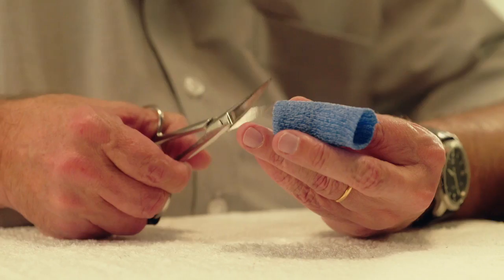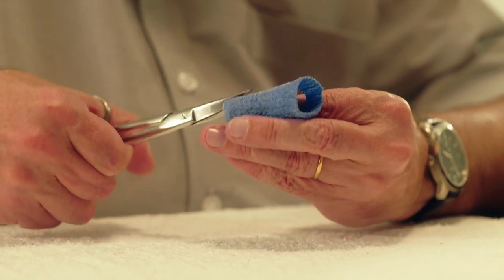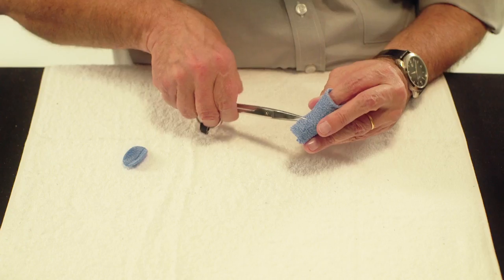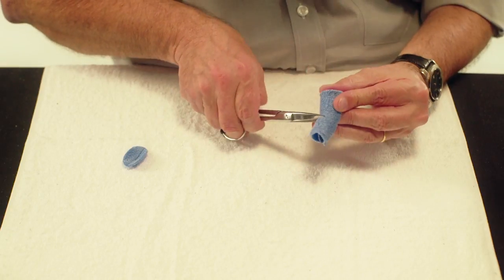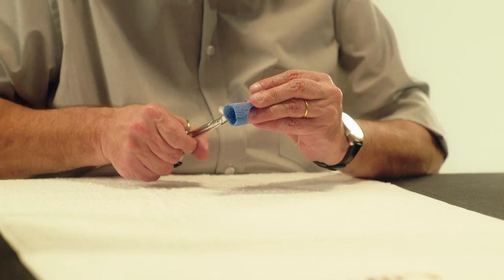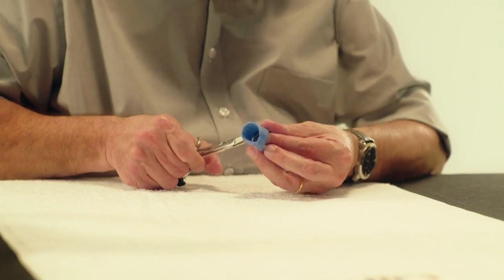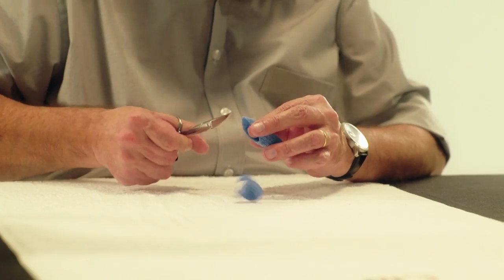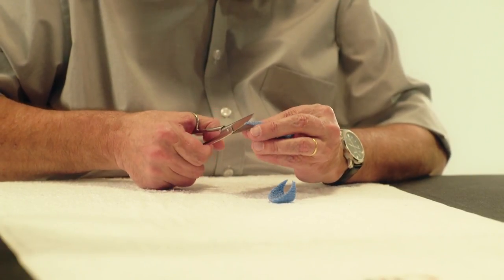Trim the orthicast from the distal dorsal surface almost to the flexion crease of the PIP joint. Repeat from the proximal volar surface almost to the flexion crease of the PIP joint, leaving about five millimeters of material covering the flexion crease of the PIP joint.